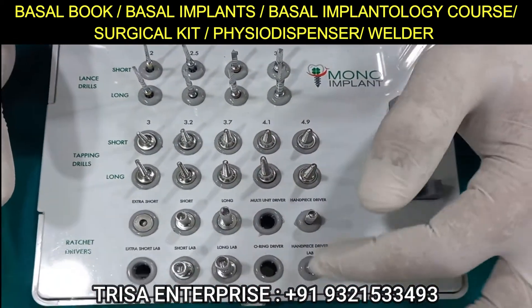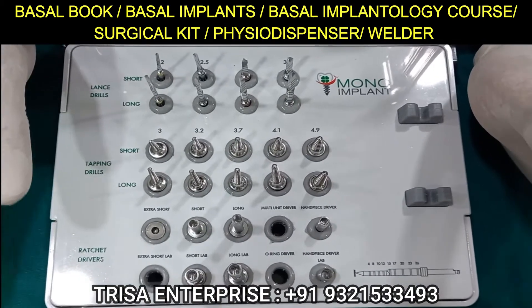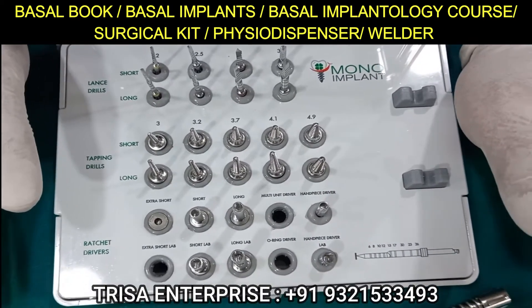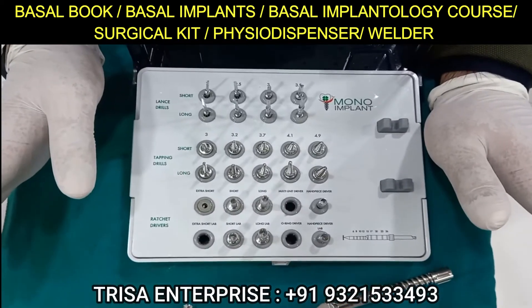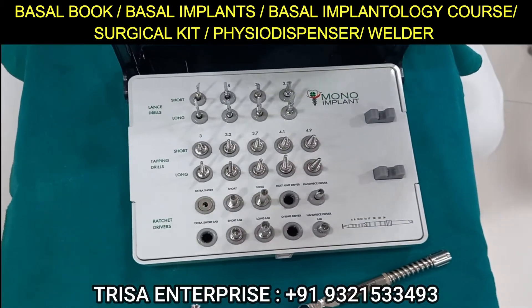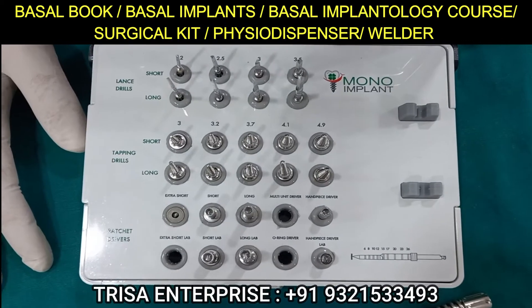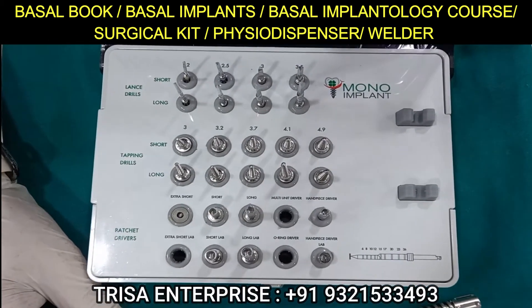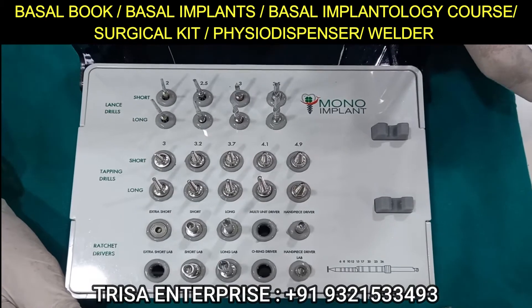The o-ring and multi-unit driver are not included in the kit as of now, but they have already been launched and should be commercially available within a week. If any of you want to make a screw-retained prosthesis, the mode of placement is the same — only the implant head will change and the impression technique will change. For screw-retained, you will take an open-tray impression, screw the impression post onto the implant, and make the open-tray impression. There is also provision to make a closed-tray impression with a screwable post. Concepts of implant placement remain the same as conventional implant.